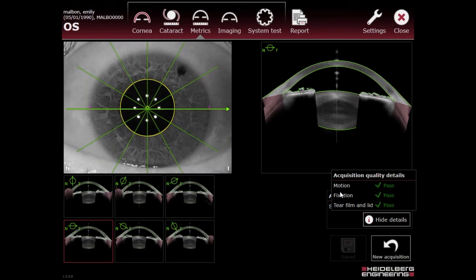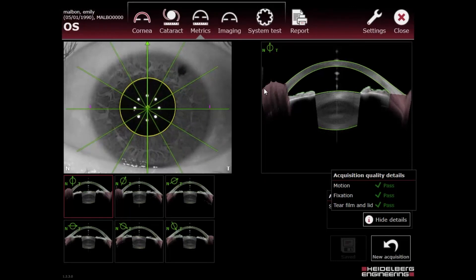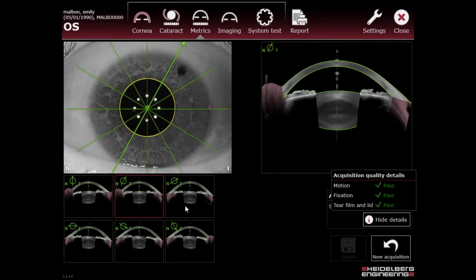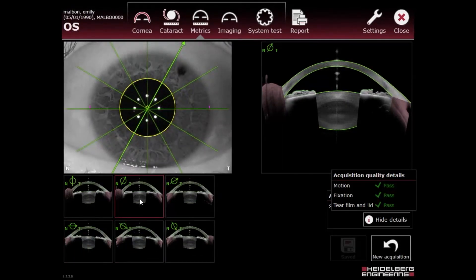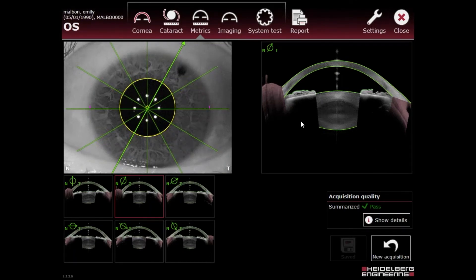The metrics app image has passed the quality test — good fixation, good tear film and lid. The trick with the metrics app: tell the patient to stare really wide to keep the lid out of the way. On the vertical line, it just caught a bit of the lid — you can see that the software makes those areas pink, indicating regions that can't be measured due to artifacts such as lid interference or distorted limbus. Here we have our six radial sections.